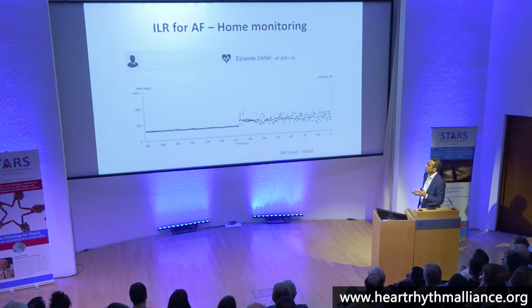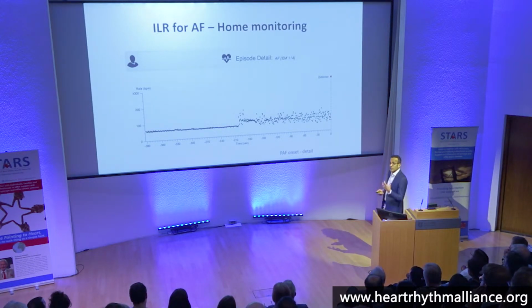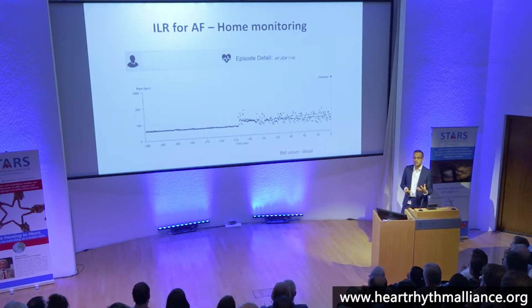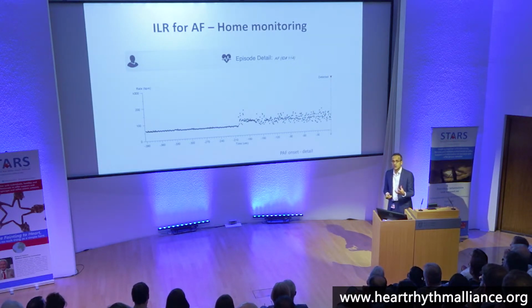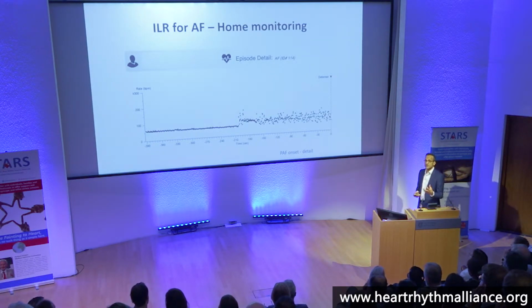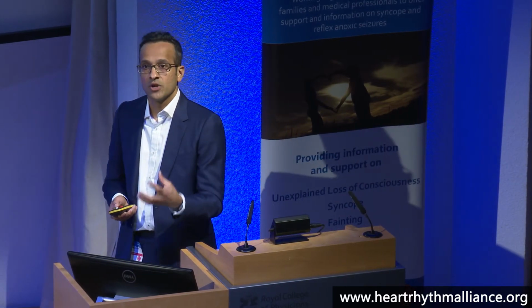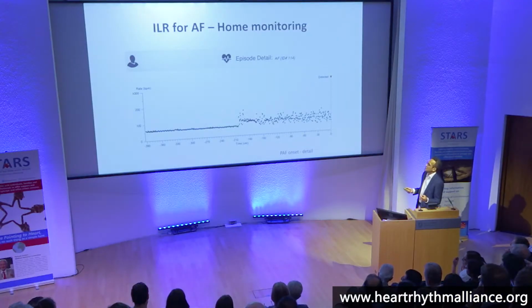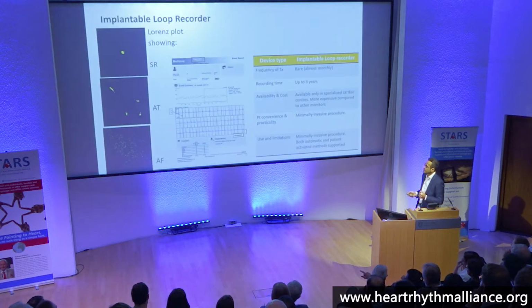Now, the technology for loop recorders has largely been driven by AF, not by syncope. And our Cinderella specialty is sort of piggybacked onto that wave, basically, okay? Because the cost benefits and the financial rewards of detecting AF early are great, whereas those for treating syncope are not as great, okay? So the technology in the loop recorders has largely been geared towards algorithms for detecting AF, variations in RR interval, okay?